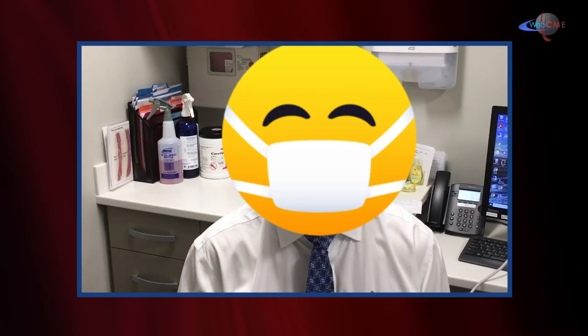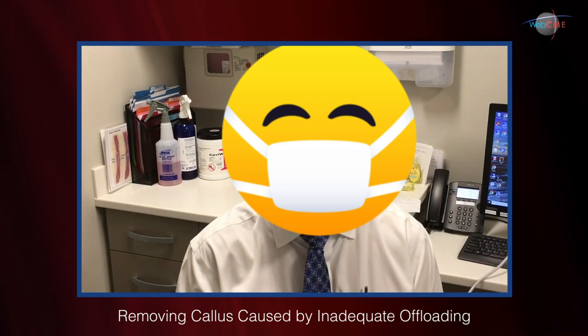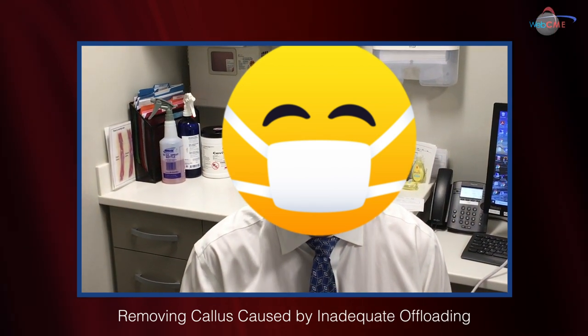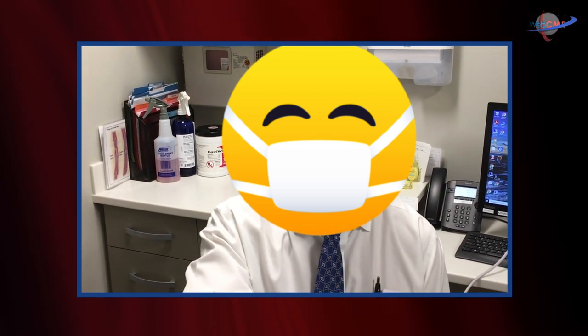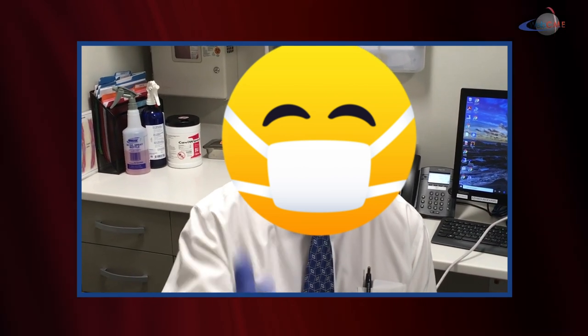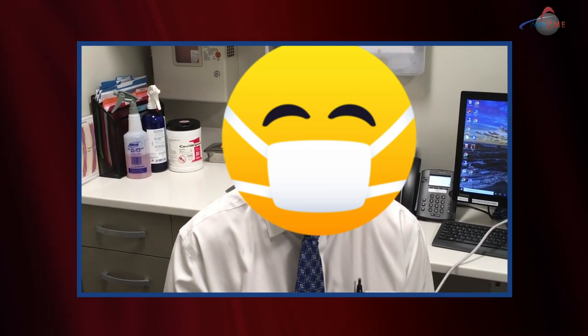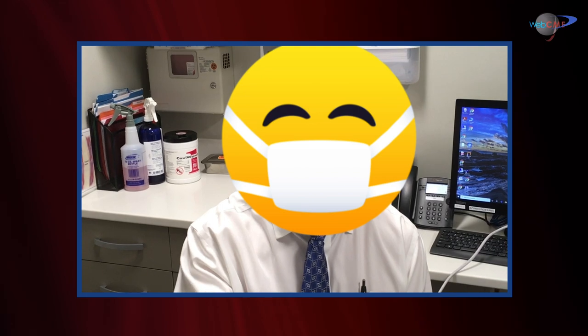Welcome back to AZH Wound Center in Milwaukee, Wisconsin. I'm your humble correspondent for this edition of the Wound Care Window. Dr. Jeopardy Skoda, thanks for joining us. Many times on Wound Care Window we do a single segment of procedure or technology and that's it. I wanted to share this patient at the start of the new year with a different approach — we'll show our initial management and then how he actually responds over the next couple of weeks.